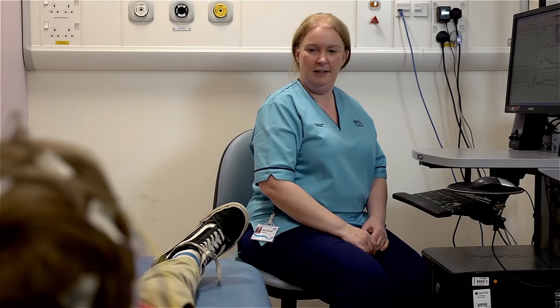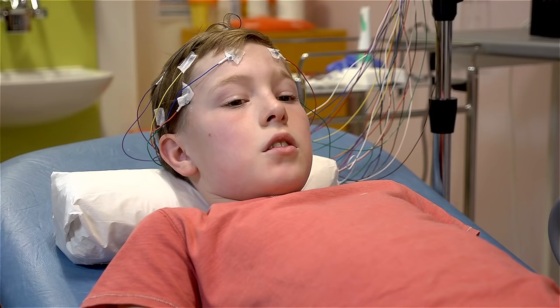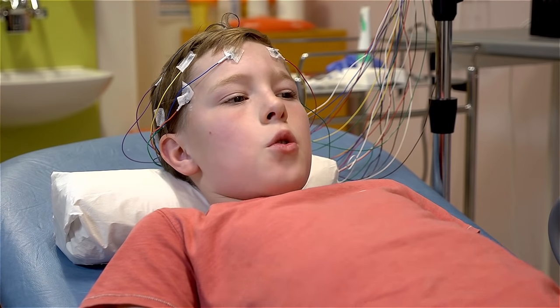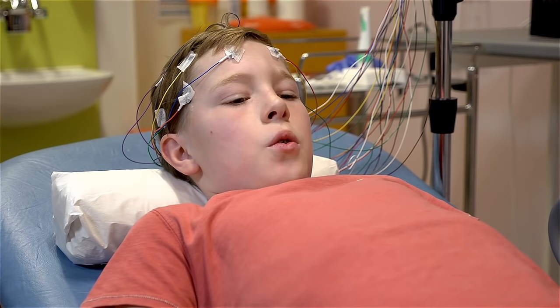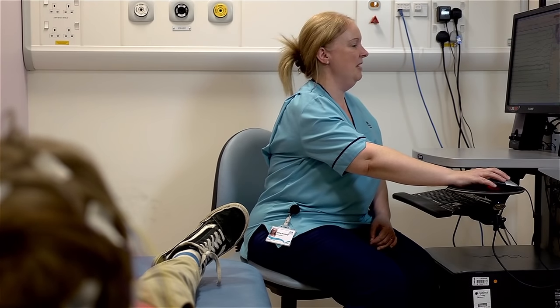You can open your eyes again. So I'm going to get you to do the deep breathing now. That's breathing in through your mouth and out through your mouth, and blowing out as hard as you can, like you're blowing out your birthday candles. Okay. So if you can start that for me now — that's fantastic. If you can keep going like that for about three minutes, and close your eyes at the same time. This might make you feel a little bit dizzy, but that's quite normal.